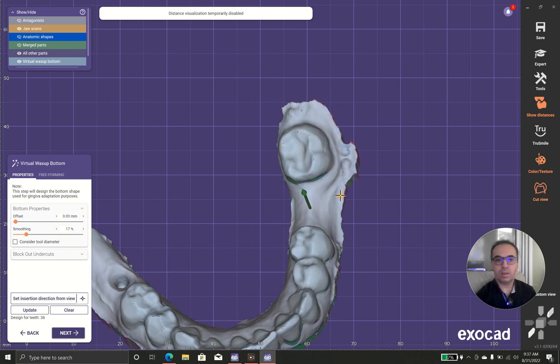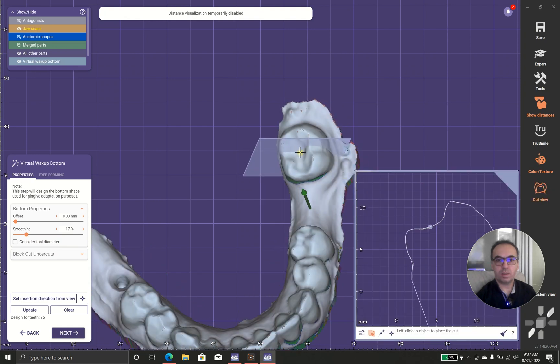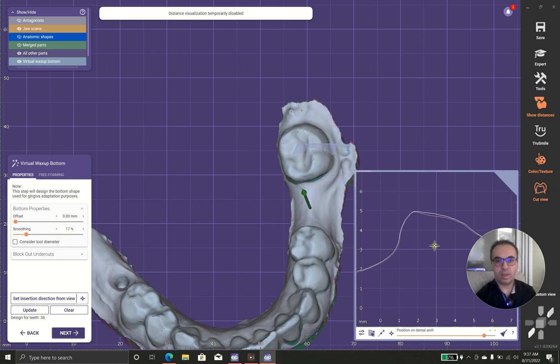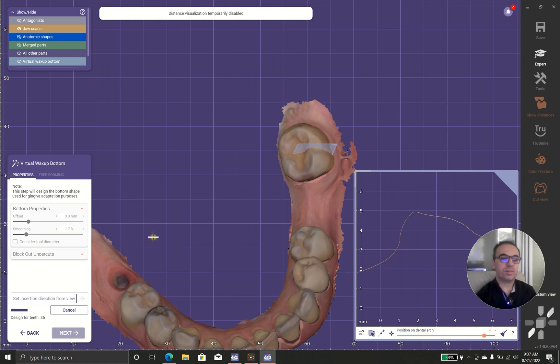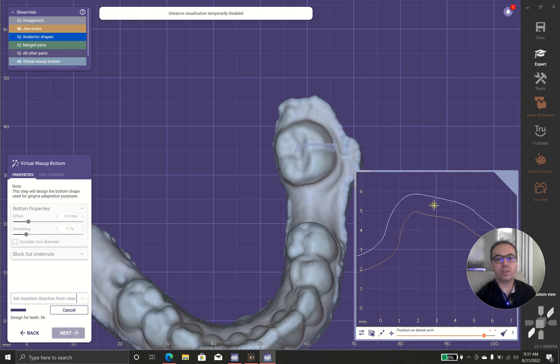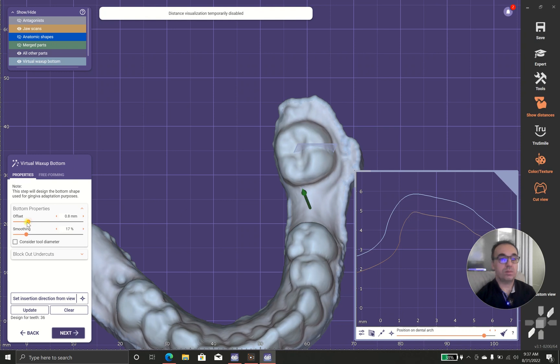In case I want to show you what happens if I increase the offset to a big number, you will see the change. The big relief means that it looks so far and it has a very big gap.